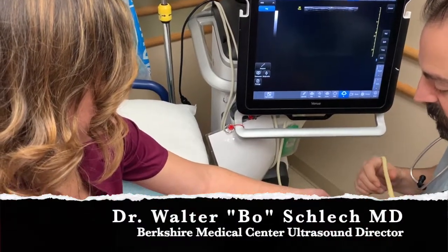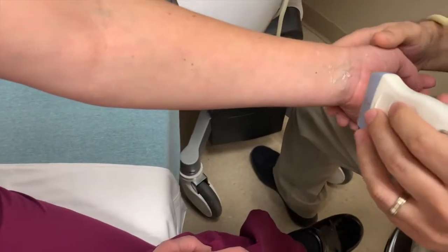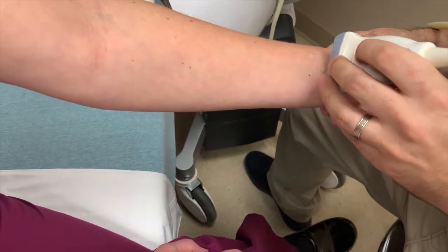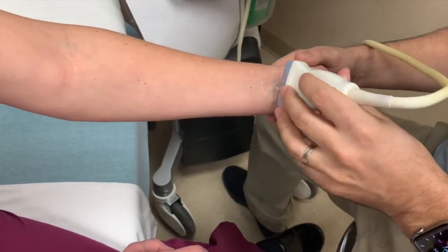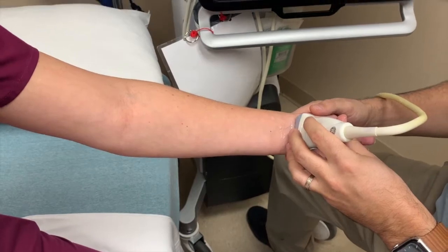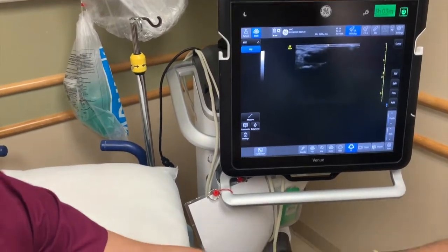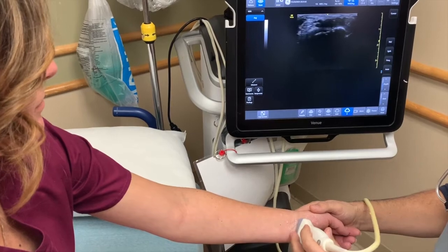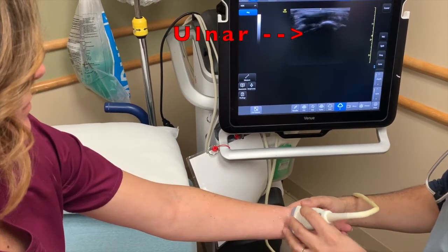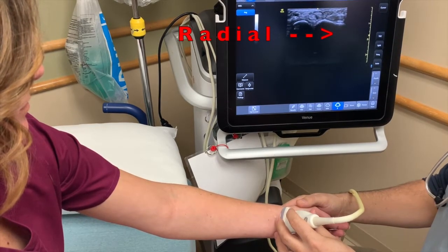We're looking at a ventral view, or palmar view, of the wrist under ultrasound with a linear probe in a transverse orientation. We're going to start by identifying some structures. Over here on the left is the ulnar side and on the right is the radial side.